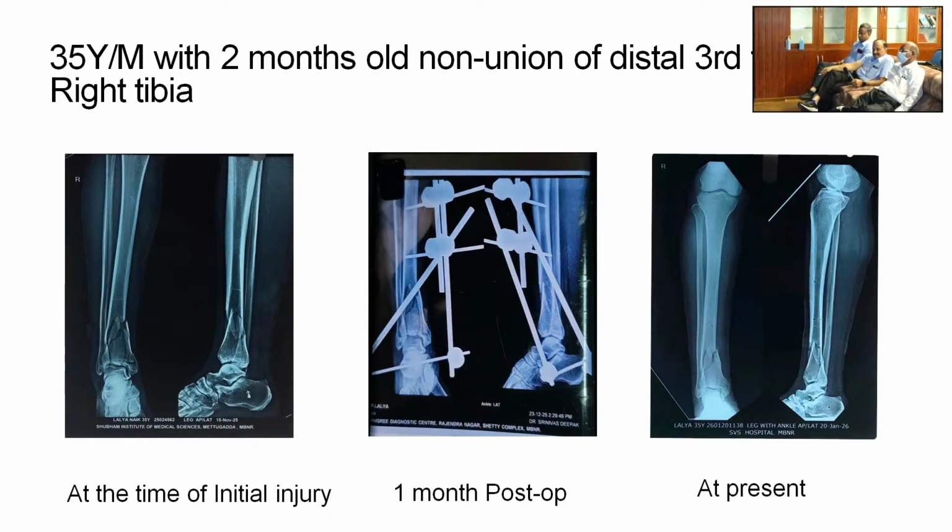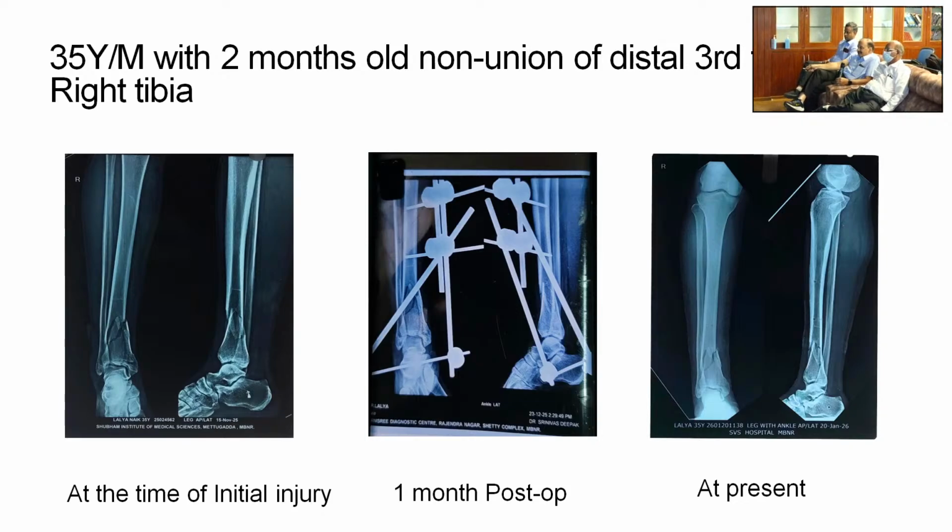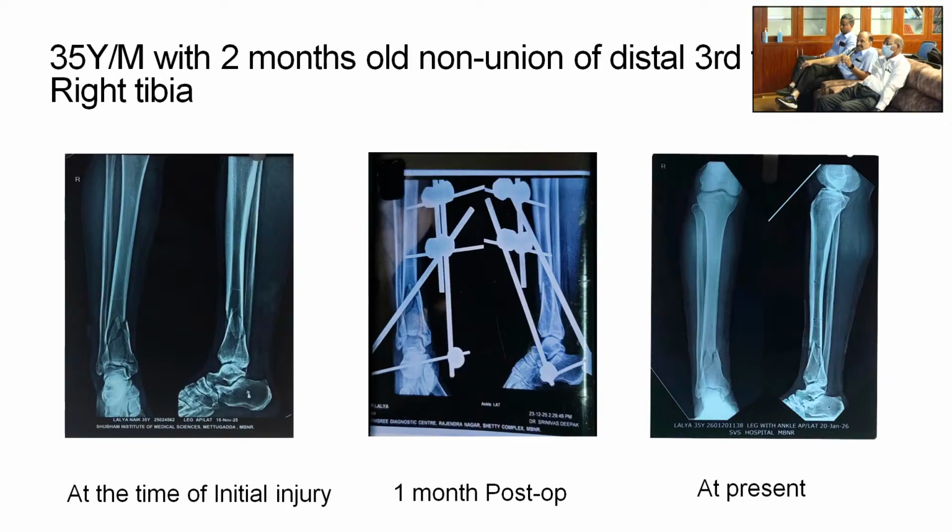More than that. Delayed union. But radiologically, do you say non-union or not? Or delayed union? What is this? Do you get non-union in metaphyseal areas? Non-union is common here. Malunion. She has not seen. No, sir, there is abnormal mobility. You will not get it.